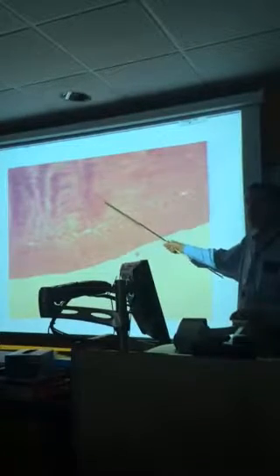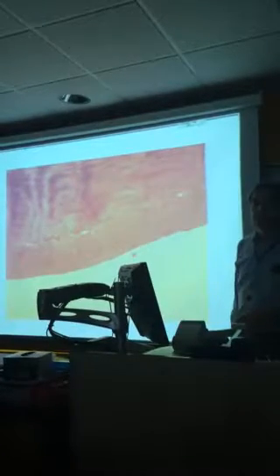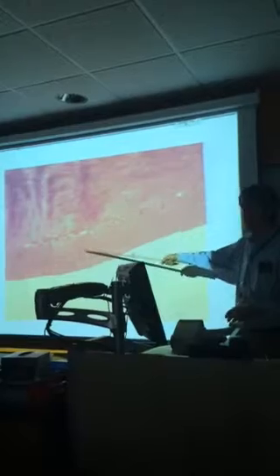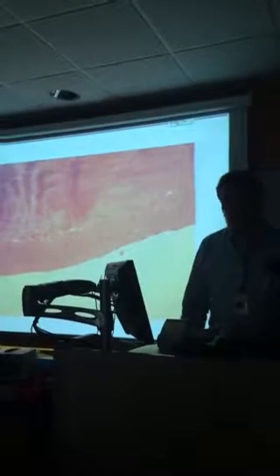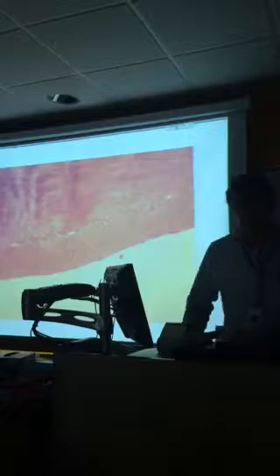So if you're asked, what's the type of tissue? Smooth muscle. Arrangement? Circular or longitudinal. Don't be stymied. What do you mean by this? It's basically giving you a dead giveaway. It says type of tissue, arrangement. It's usually smooth muscle. Arrangement is either circular or longitudinal.